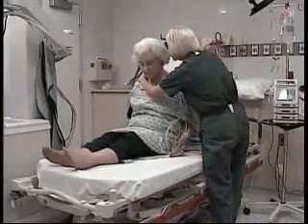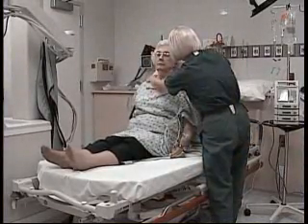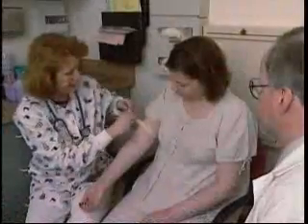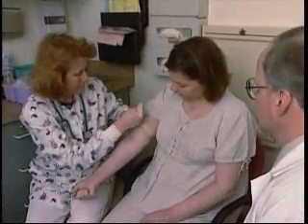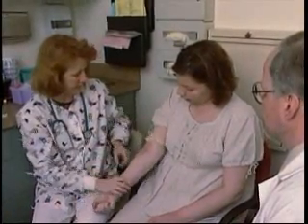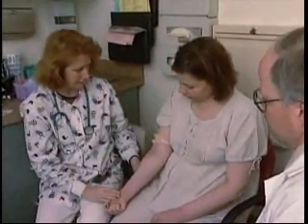Thorough assessment of the patient's peripheral vasculature will assist the nurse in the site selection process for catheter insertion. Prior to any assessment processes, however, the patient must be placed in a reclining or semi-recumbent position. If the patient cannot be placed thusly, then he or she should be seated comfortably. The upper extremities should be readily visible and accessible for physical examination and possible catheter insertion.